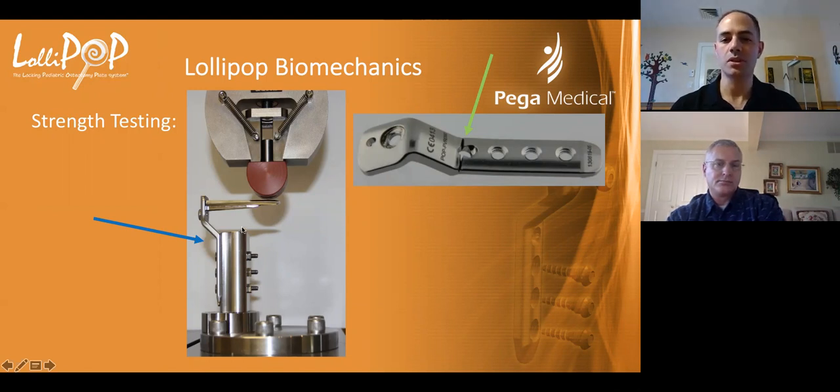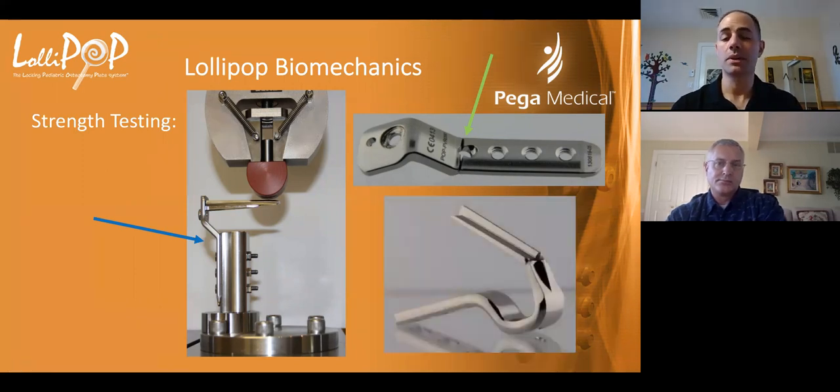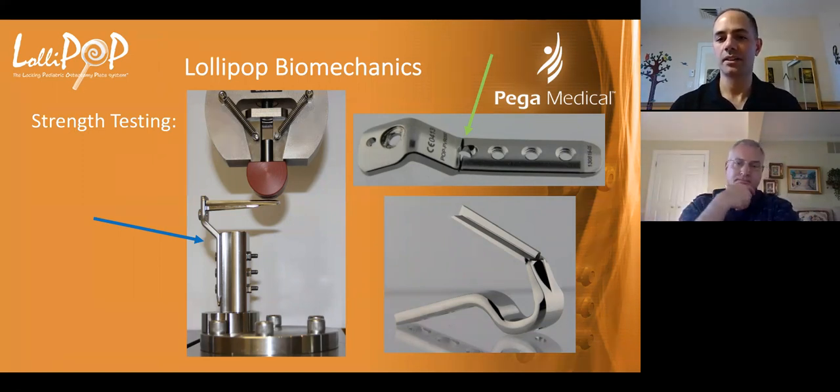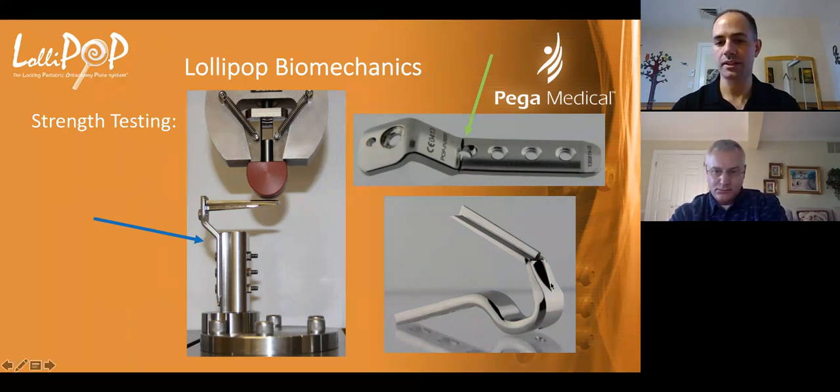So as you can see on the image on the right corner, our plate, like many plates, will fail through the most proximal screw hole at the narrowest portion. And we're talking above recommended usage loads, but that's a preferable failure site. Because if you were to put a very small plate on a child that you lose to follow-up and they become an obese adolescent and break, it'll break through a screw hole, which makes the whole thing much easier to remove. Here, in comparison, we have a Synthes blade plate that was tested on the same construct that broke at the transition of that T profile, which would be much more of a catastrophic failure.